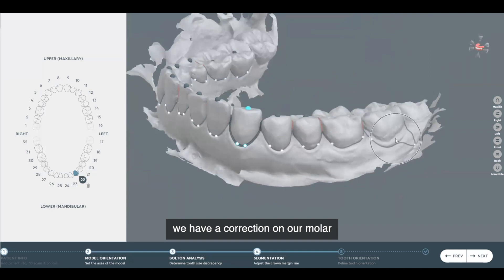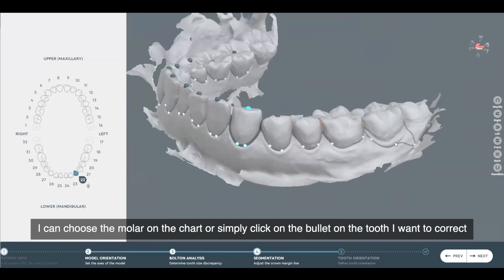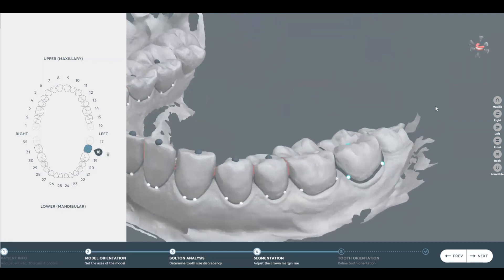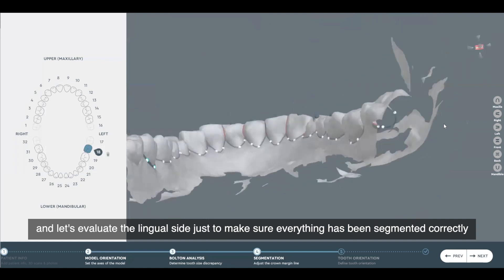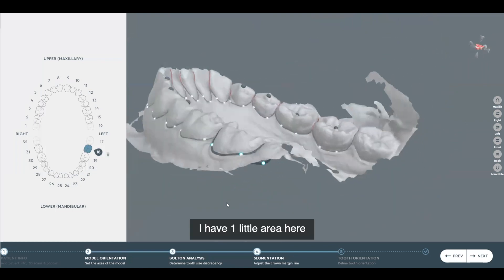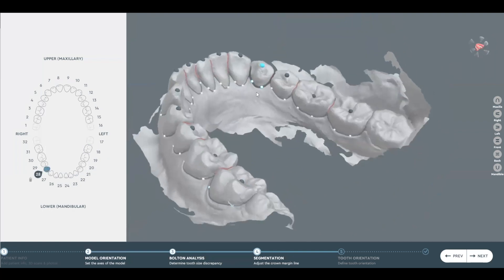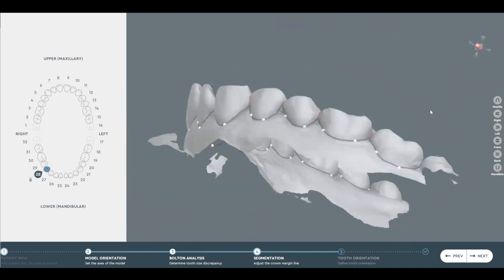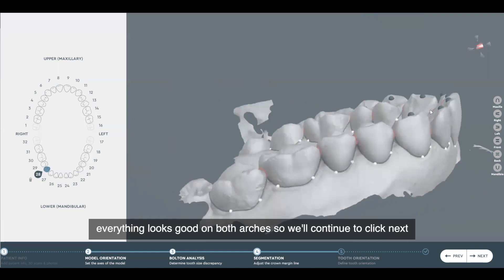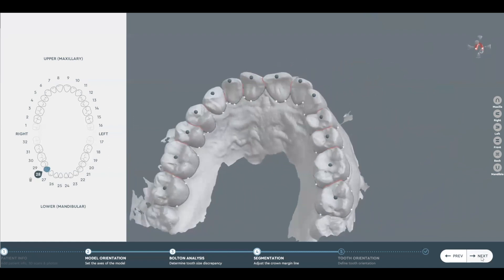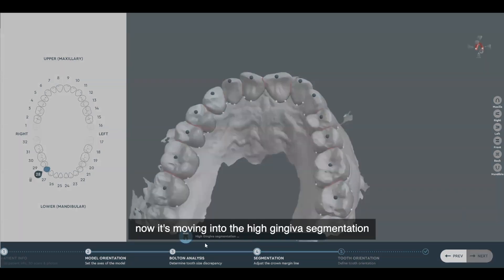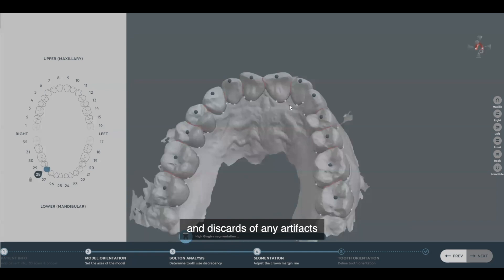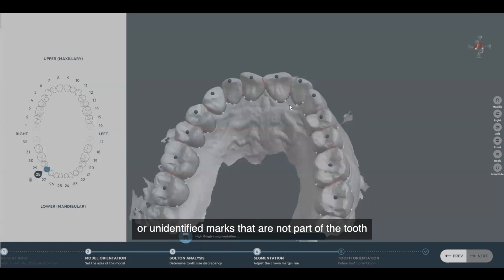We have a correction on our molar, so I can choose the molar on the chart or simply click on the bullet on the tooth I want to correct, grab it, and make my corrections. We'll also evaluate the lingual side to make sure that everything has been segmented correctly. We'll make sure the lingual of our upper is good as well. Everything looks good on both arches, so we'll continue to click next.